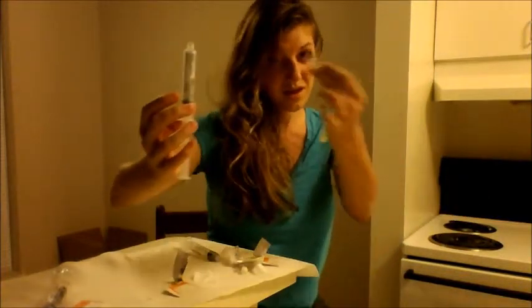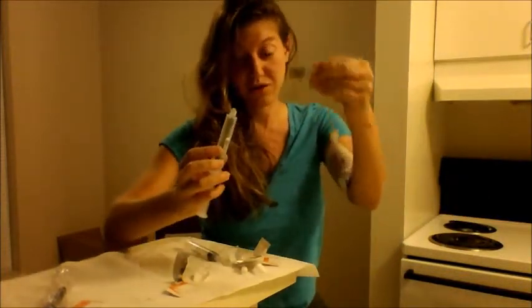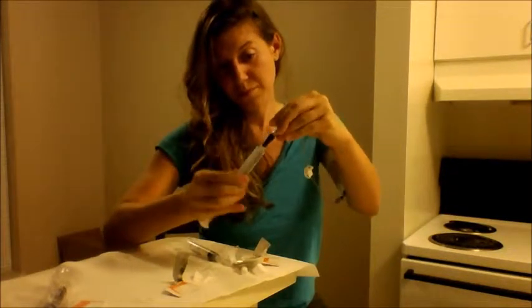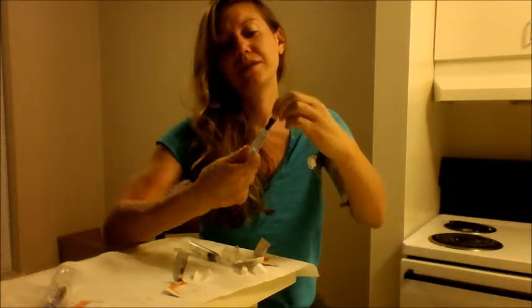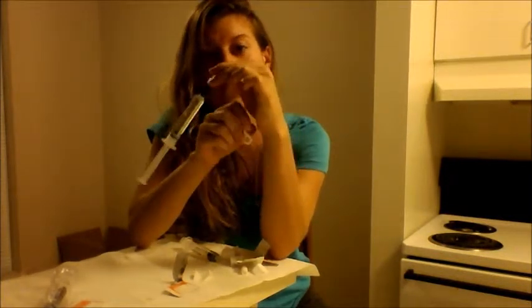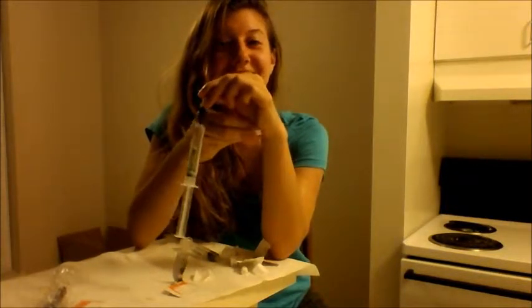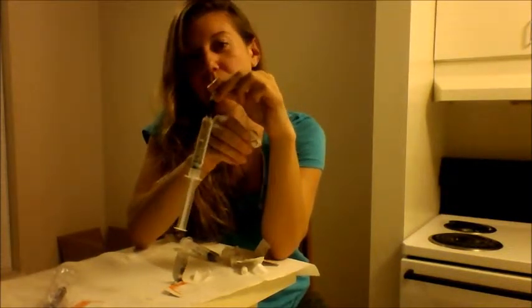This hasn't touched anything yet except alcohol — I haven't let it touch anything. Also, I washed my hands before I did this, obviously. Now I can open this valve — pop open this valve.